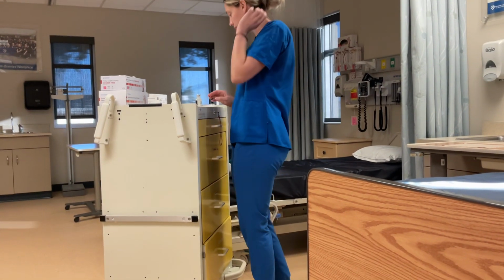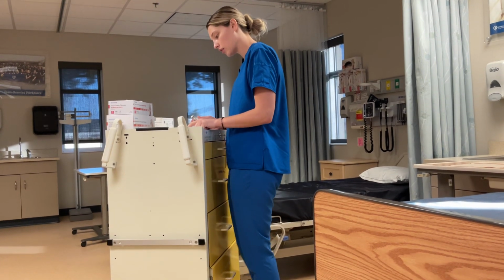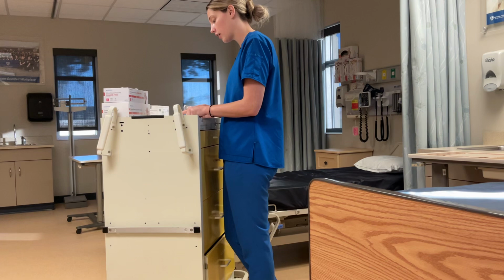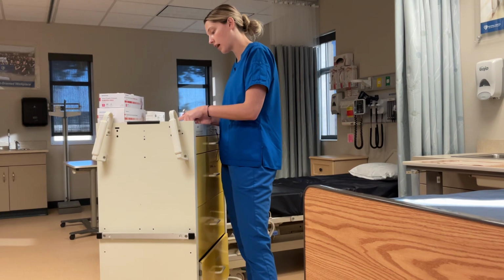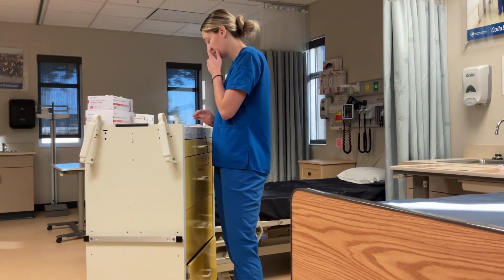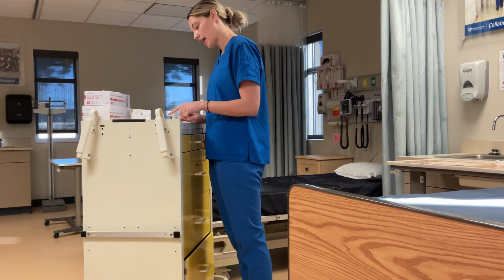And then I would look at my MAR for right patient, which is Joe Smith, right medication, which is ketorolac, Toradol, their correct dose and the correct dose calculated. 30 milligrams IM, so right route, every 6 hours PRN for moderate to severe pain. For today's purpose, I'm just going to be given 1 ml of ketorolac.